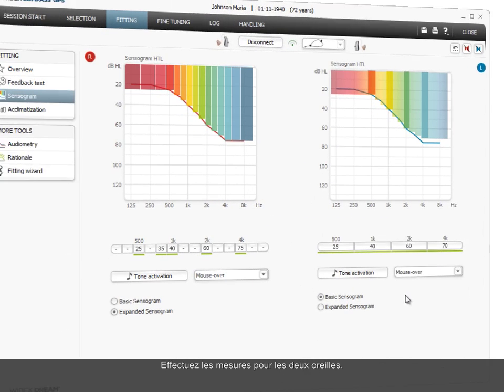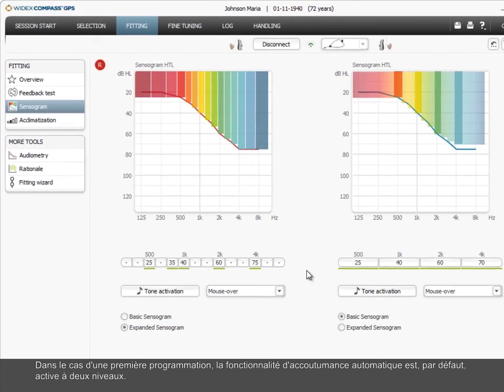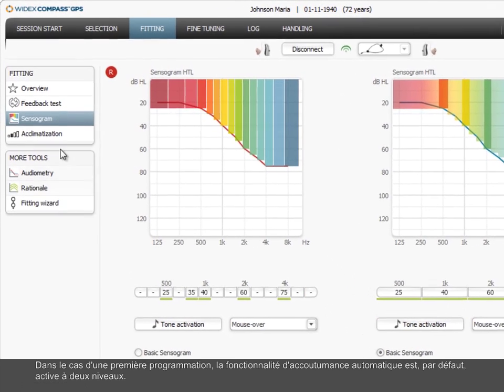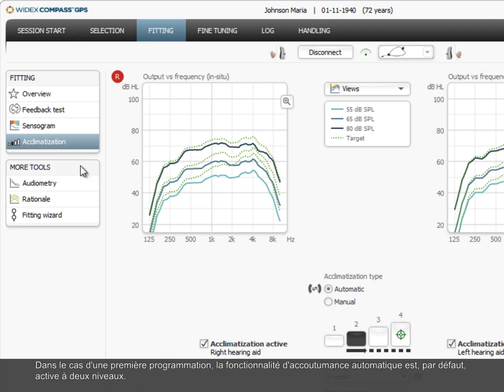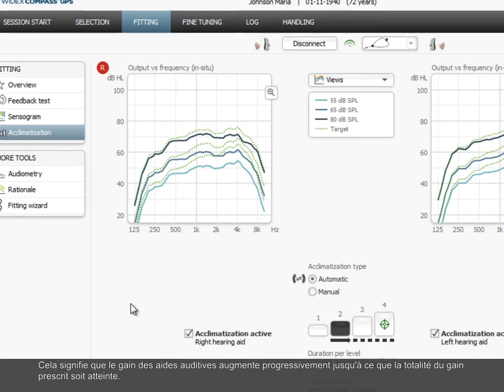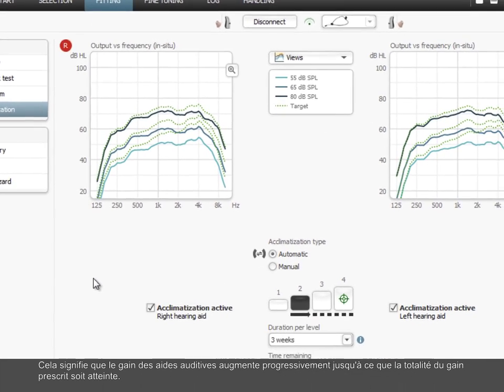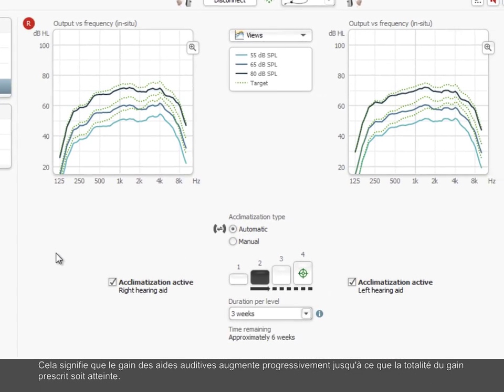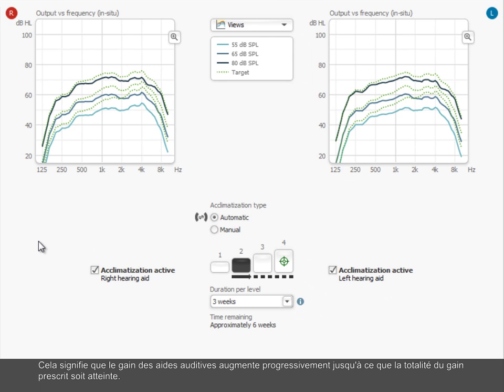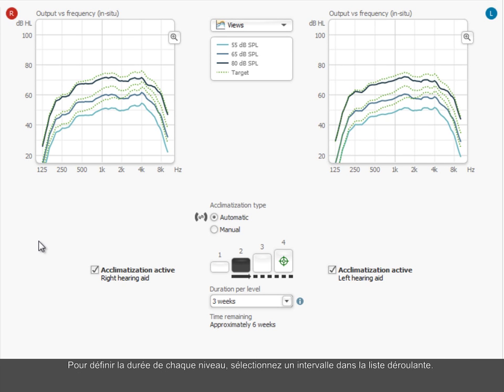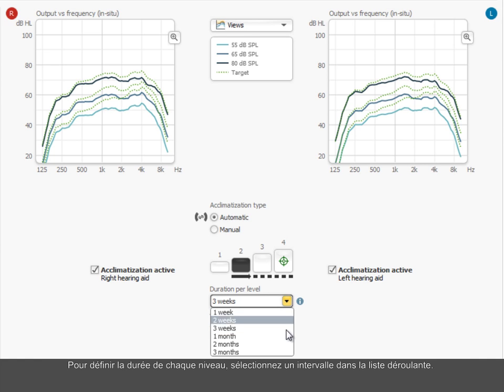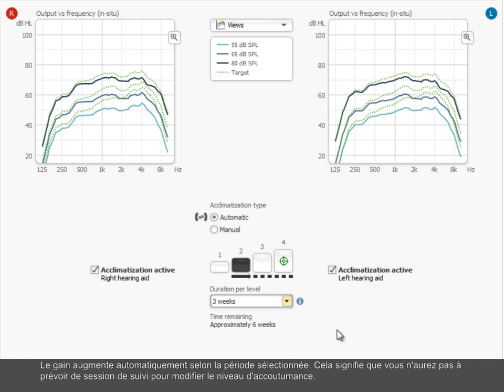In a first fitting situation, the automatic acclimatization feature is turned on by default at level 2. This means that the gain in the hearing aids gradually increases until the full prescribed gain is reached. This helps the user to get accustomed to the amplified sound. You can change the acclimatization level depending on the user's needs. To define the duration of each level, select an interval in the drop-down list. The gain automatically increases according to the selected period. That means you will not have to book a follow-up session just to change the acclimatization level.